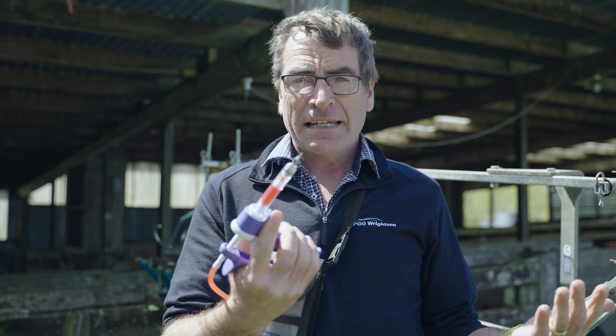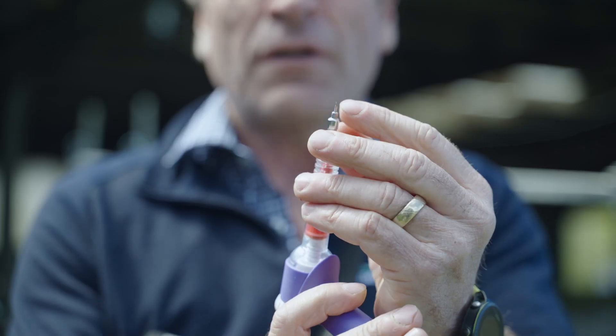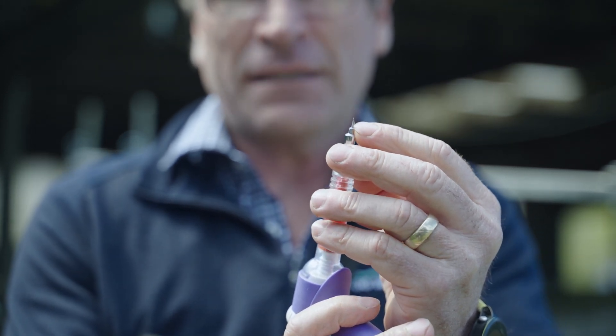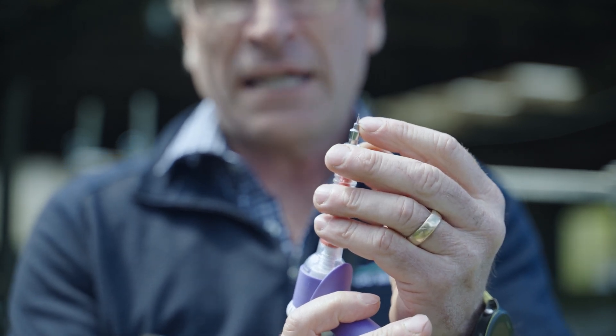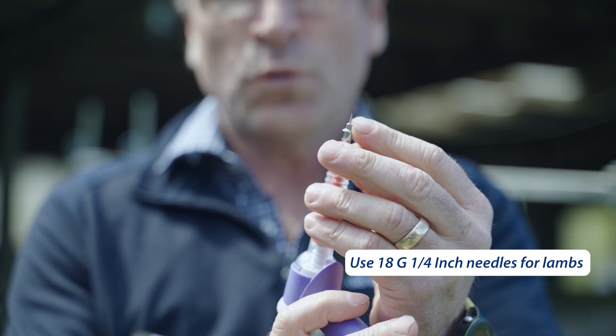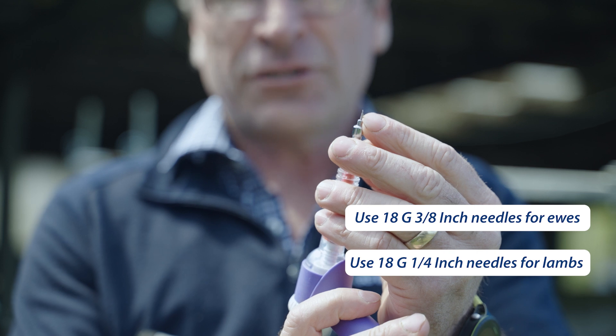Today, because we're vaccinating lambs, I'm using 18 gauge, quarter inch needles. They're a little bit shorter. That lamb doesn't have the same amount of fat in its neck to protect the muscle, and if I inject that muscle, I might cause a lesion which will be downgraded at the works. So in lambs we use 18 gauge, quarter inch needles, whereas in ewes I'd use an 18 gauge, three eighths inch needle.